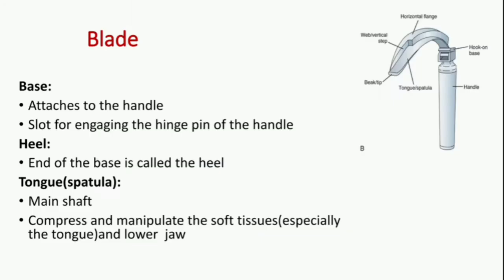The blade has a base, a heel, and a tongue or spatula. The base attaches to the handle and there is a slot for encasing the hinge pin of the handle. The endpoint of the base is called the heel. The main shaft is known as the tongue or spatula, which compresses and manipulates the soft tissues, especially the tongue and the lower jaw.